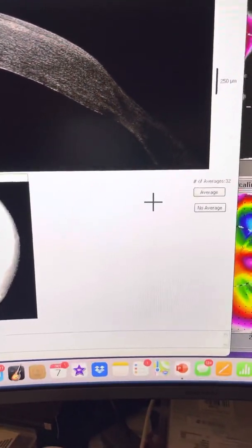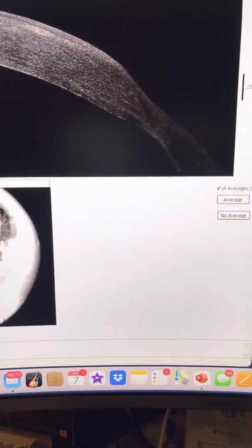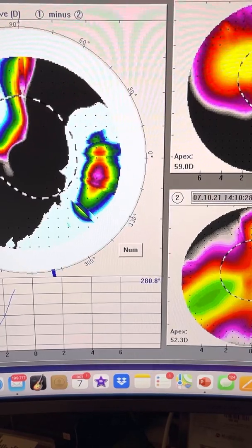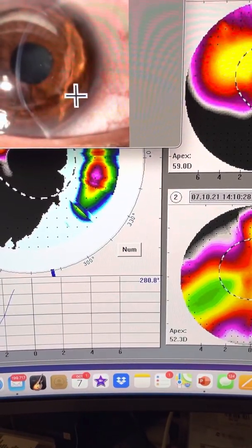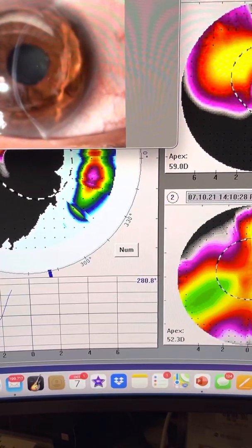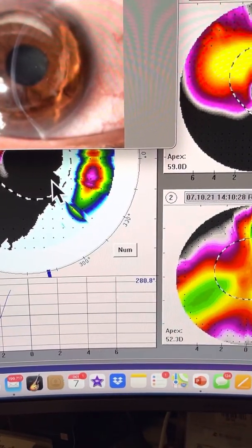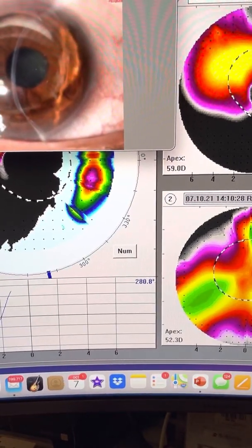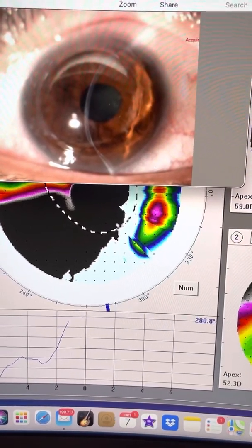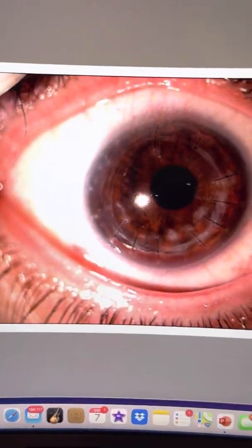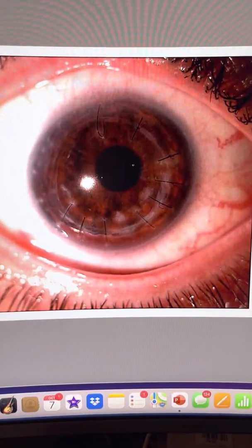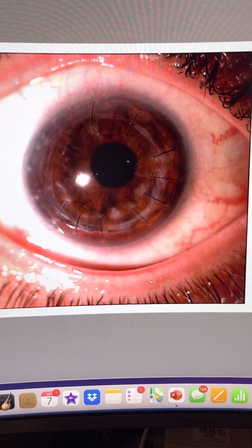We can, of course, pick it up on the slit lamp. And this is definitely an alternative option. Instead of re-grafting the patient, we can certainly just open the incision, subtotal, re-suture it. We placed here 16 interrupted sutures, soak the graft-host interface with riboflavin and perform the flash cross-linking treatment in order to attain the results that we had today, which is a graft that looks like it's been a year out, relatively good cell count. We're about 1,200 cells.